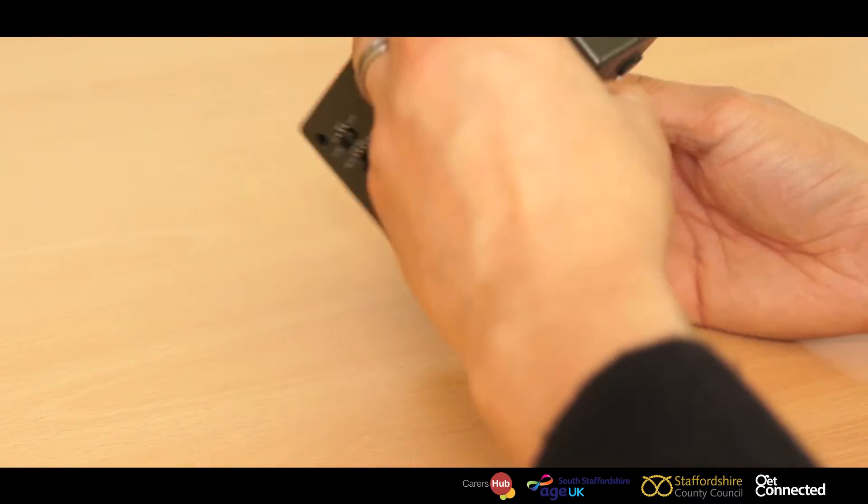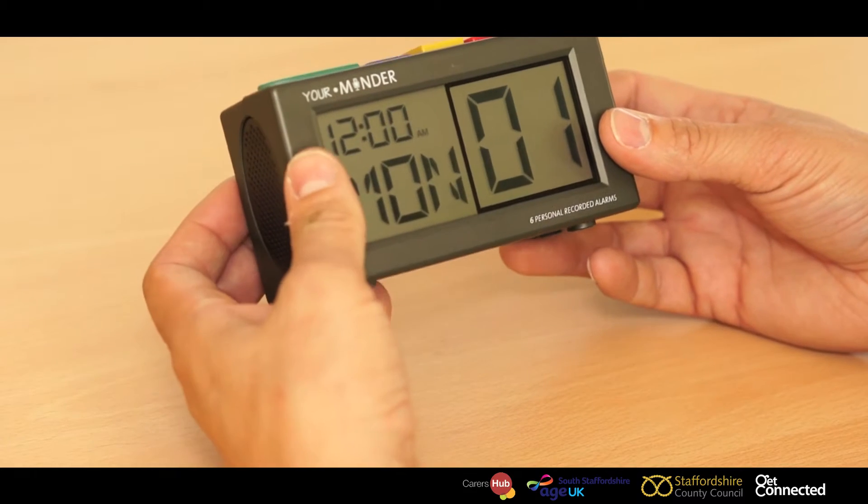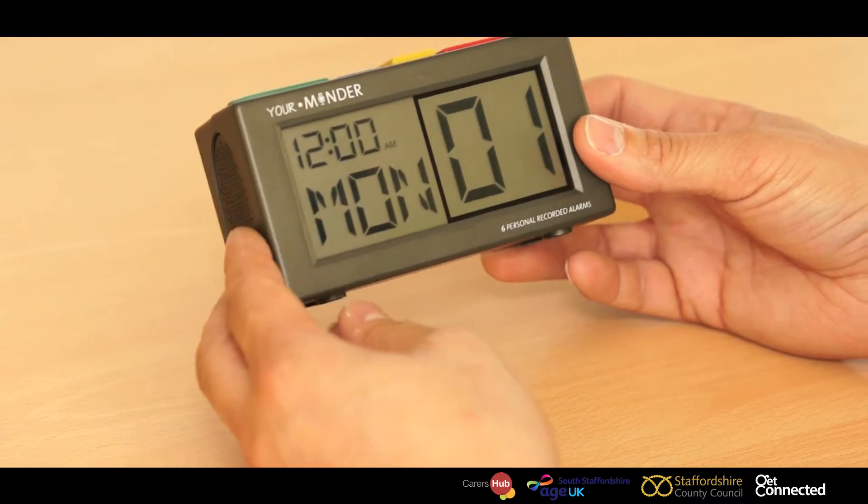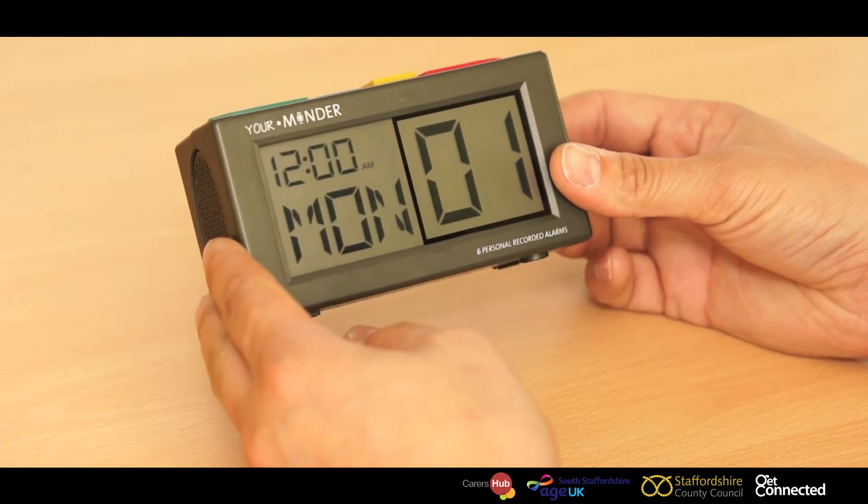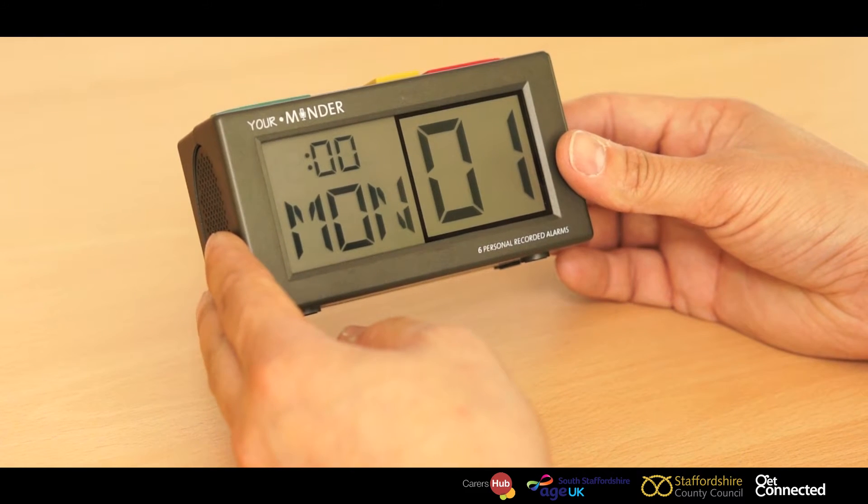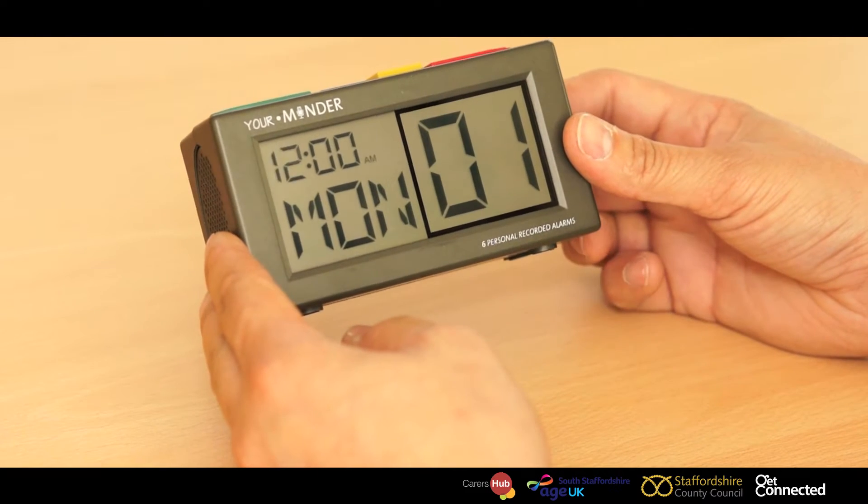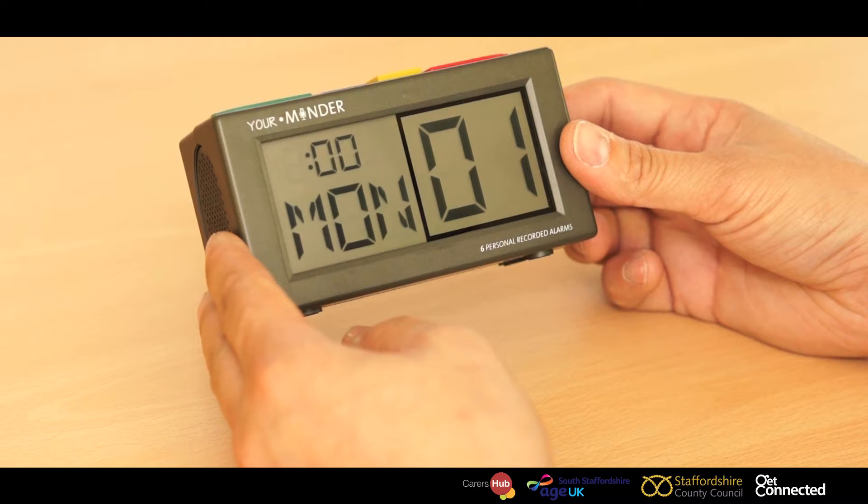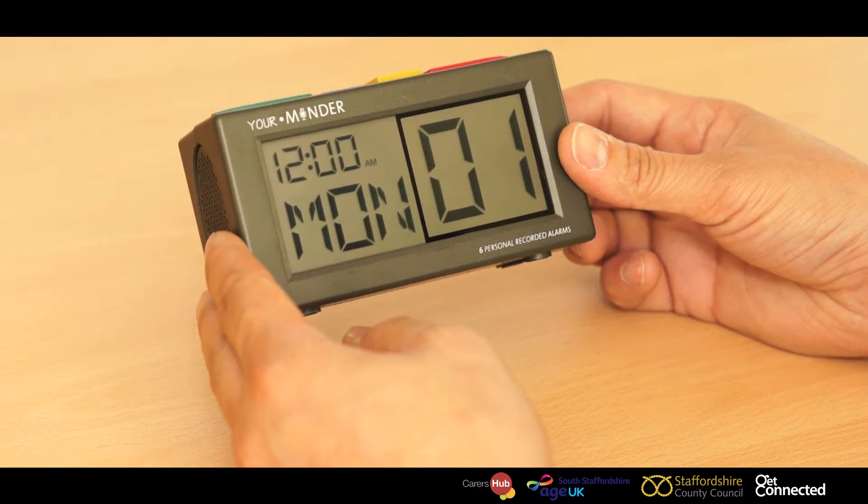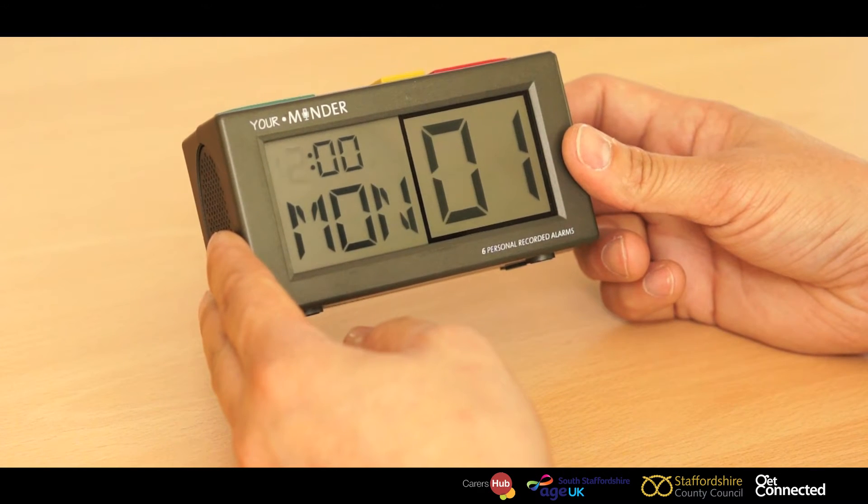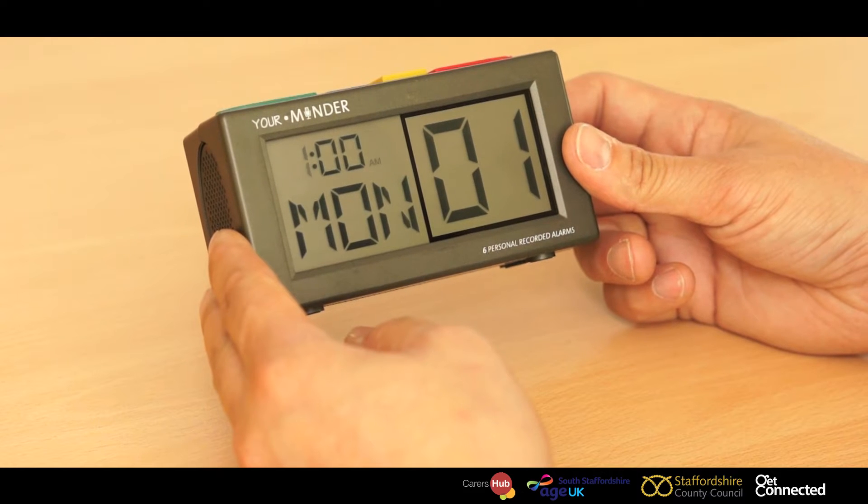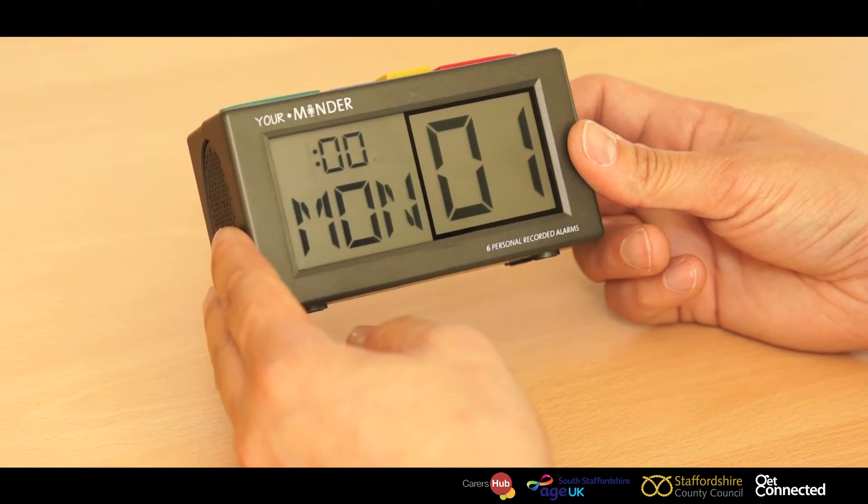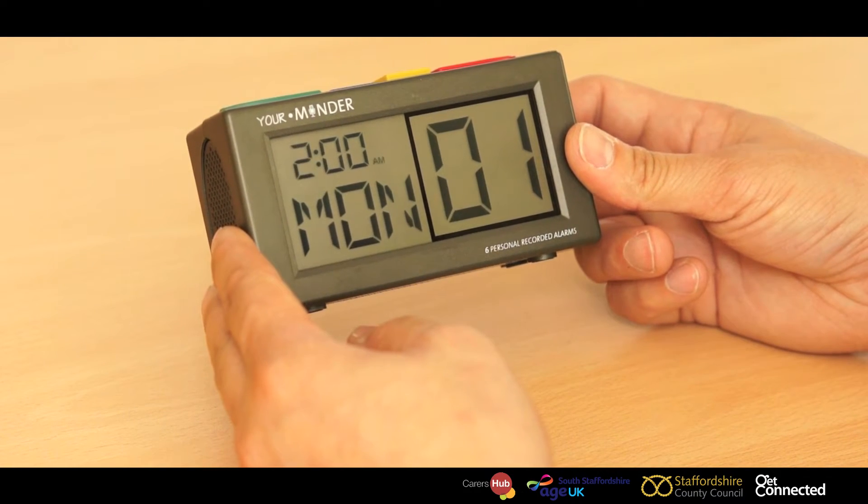If we spin it around, if we push the green button once, the set and advance button, it will now move into hour option. We now use the plus and minus symbol to advance through the minutes and hours. So we're going to set it. All you do is you keep pressing the button until you get to the appropriate hour.